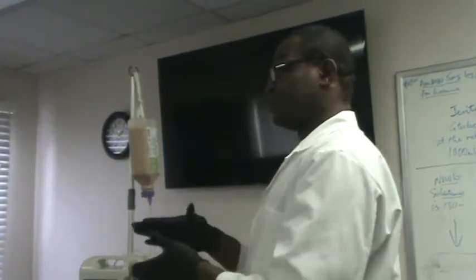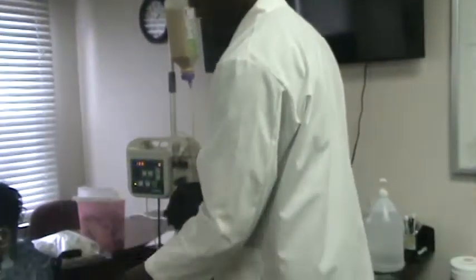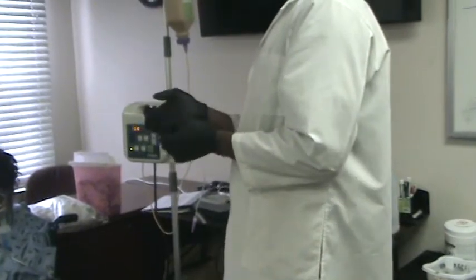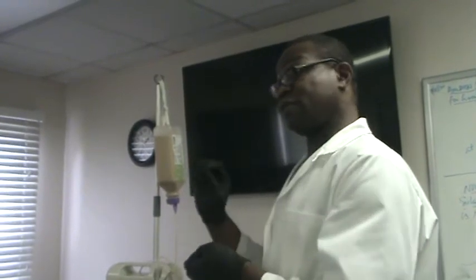So that's different from the flush. So in between the feeding, you're going to be giving her water. Same way, just get your cup of water, disconnect the feeding, put it on hold, insert, put the plunger in there, then give her the water. Maybe it's a cup or 2 cups. It will be ordered, and then you have to sign for it that you gave her the water.